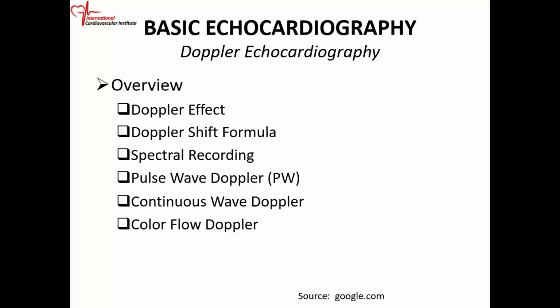If you want to quantify, say, a regurgitant lesion, that's Doppler. So Doppler is, again, an integral part of echocardiography. It allows us to quantify things, and so you will see that.